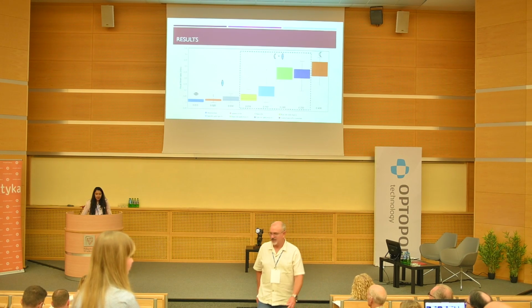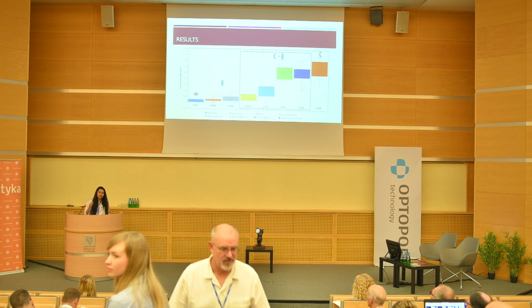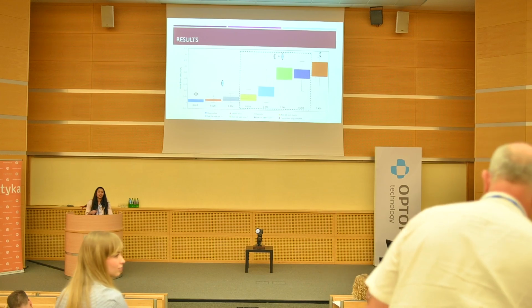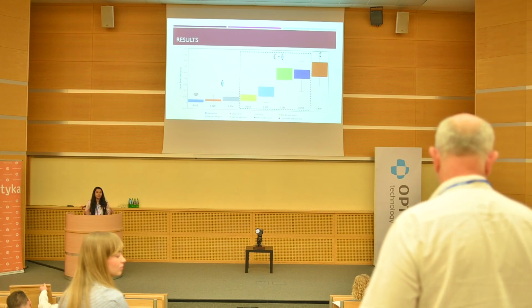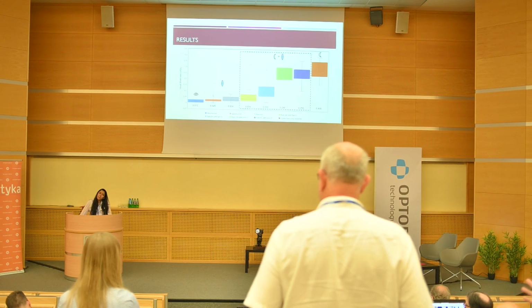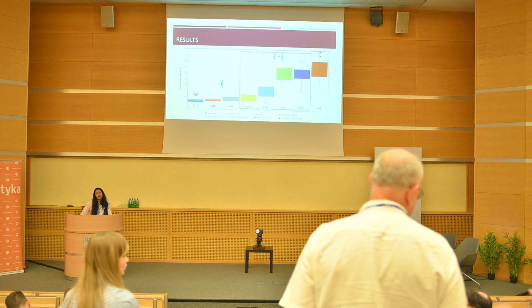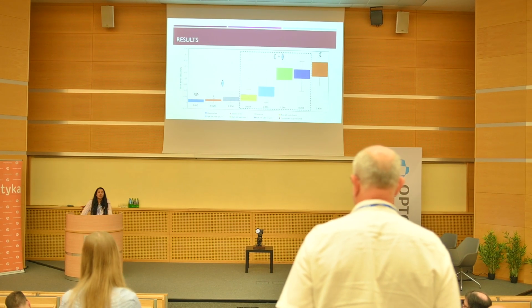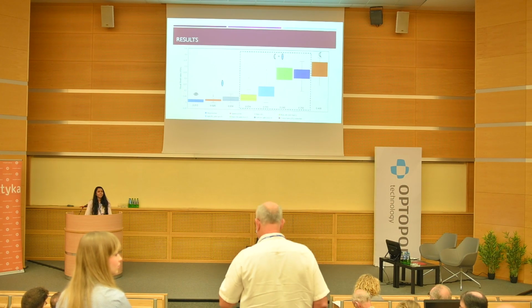Maybe it works, but if I make necessary changes in the IOL according to the contact lenses, it's just that when the contact lens is off, the difference could be a bit more staggering. You could change the anterior surface of the contact lens to compensate for part of the spherical aberration introduced by the intraocular lens. So that's why you have that difference in result, because you have a mismatch in spherical aberration. Thank you.